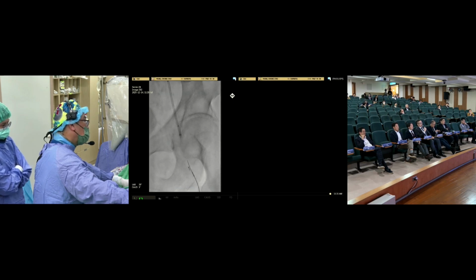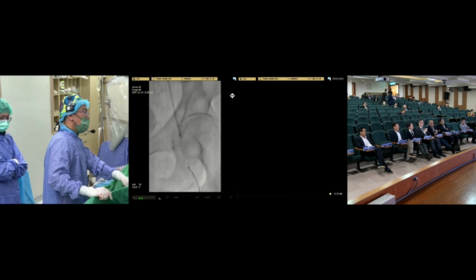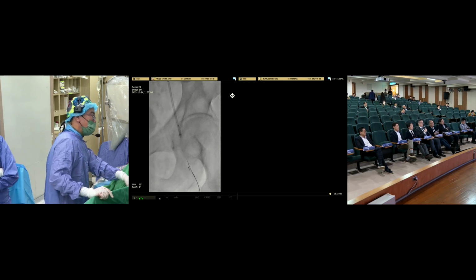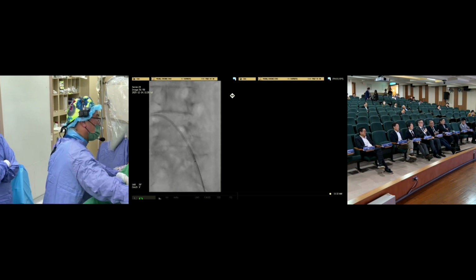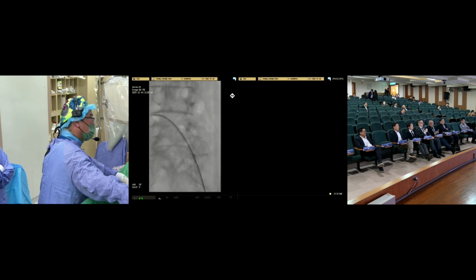And Dr. Zong, which is the best place for you to create a connection between two wires, more proximal to the ostium, or... When we punctured, it passed to the true lumen, and externalization. Oh, congratulations. Direct entry, too fast. Guiding catheter.